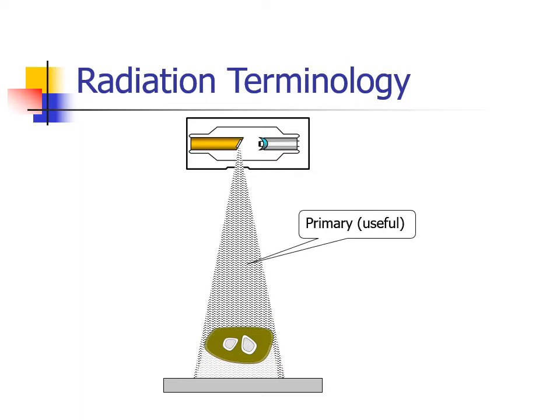As in all radiographic setups, we start with an X-ray tube positioned at a standard distance above the X-ray table and patient. Next comes the patient or object being radiographed, centered below the tube. Finally, we have an image receptor positioned below the patient. The primary radiation exits the tube.